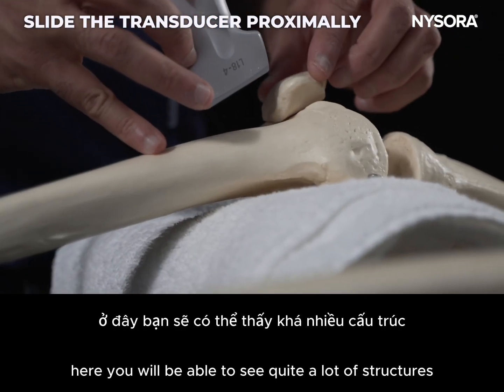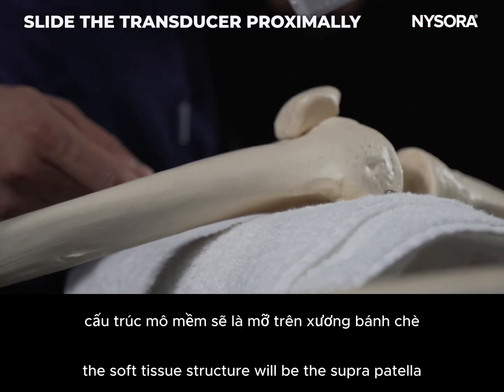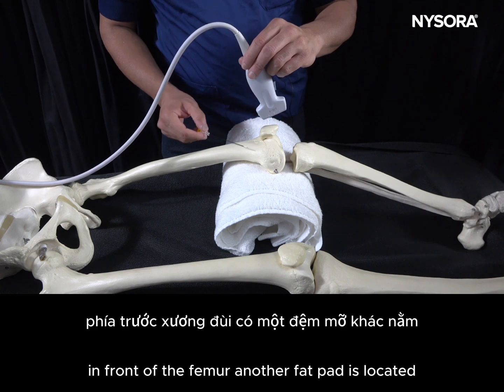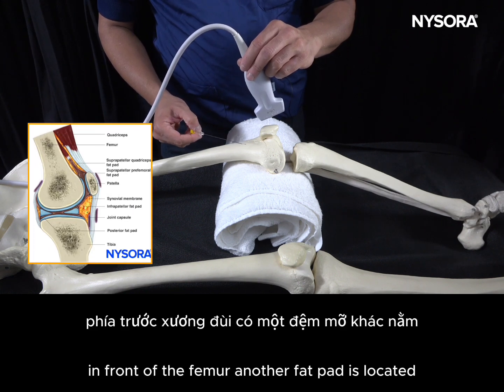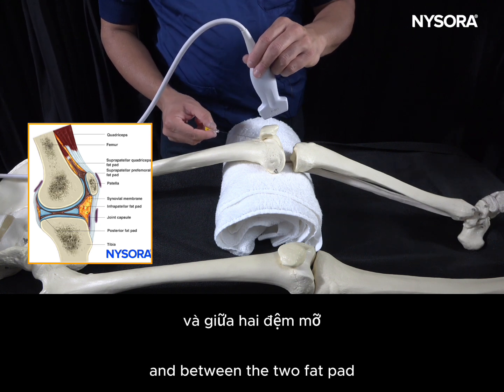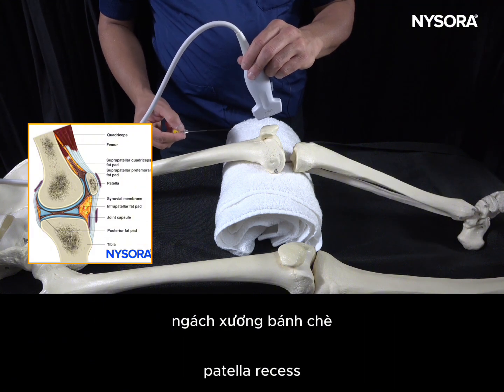Here you will be able to see quite a lot of structures. On the top of the patella, the soft tissue structure will be the suprapatellar fat pad. In front of the femur, another fat pad is located. That's the prefemoral fat pad. And between the two fat pads, you'll be able to see the outpouching of the suprapatellar recess.